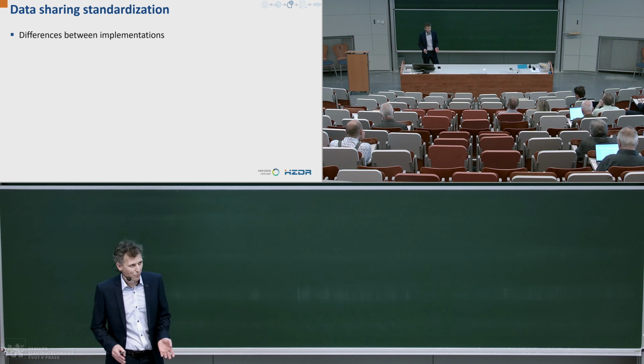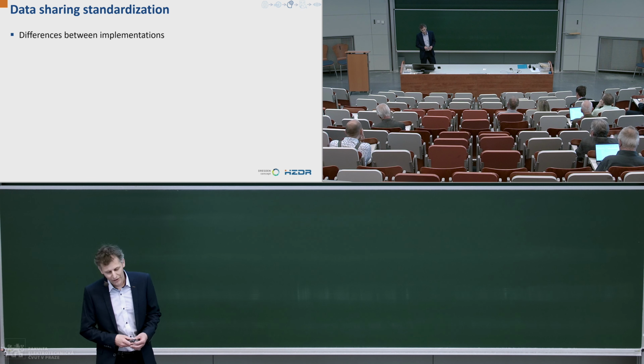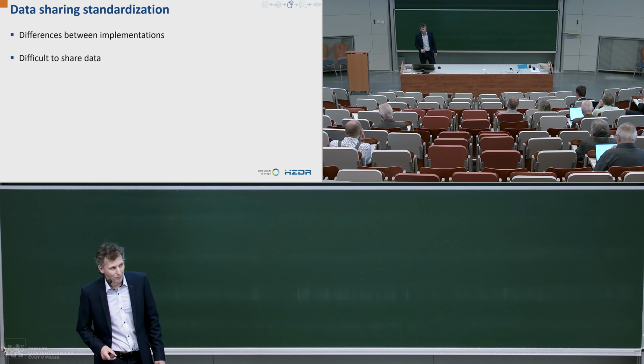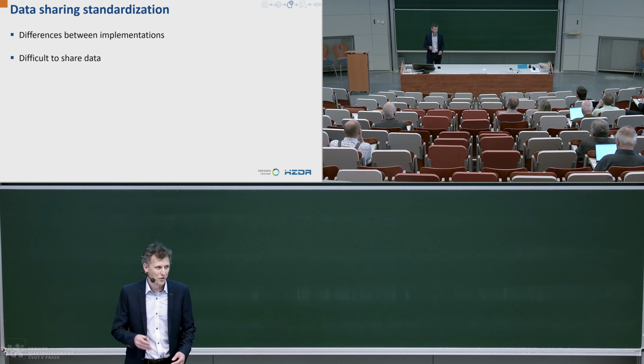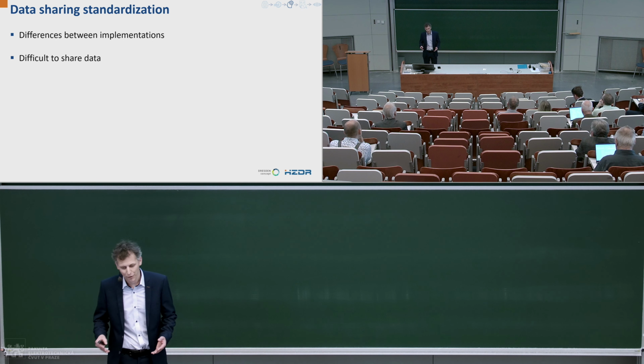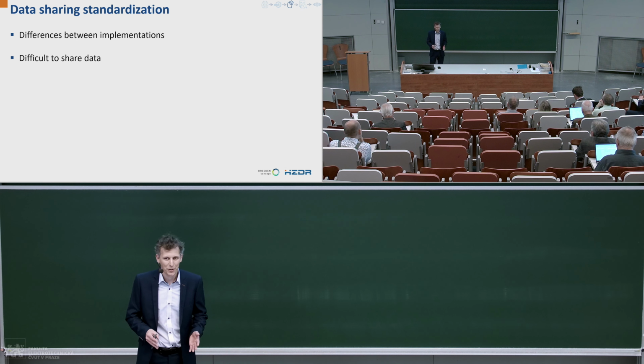All the different MRI producers have their own implementation, and while these methods are fairly standardized, they are not really standardized in the way they save their data and all the parameters necessary for quantification. So it is really difficult to share data if you don't have all the information about the data, because you cannot later quantify it. And of course, this looks like a very simple task. You just take all the measurement parameters and this is what you need. But of course, in practice, this doesn't really work.